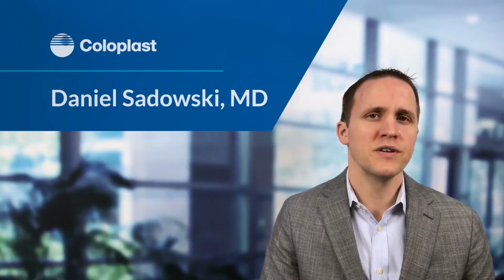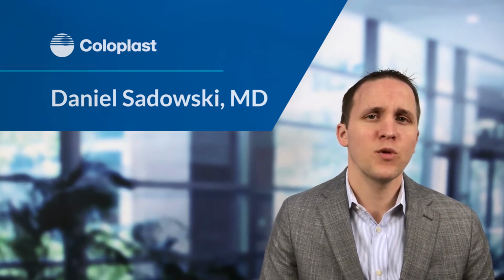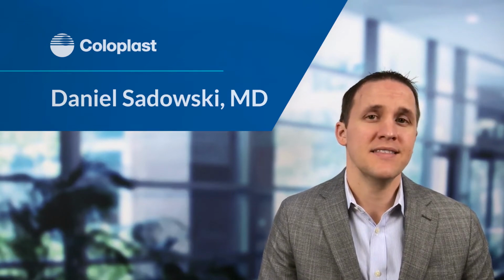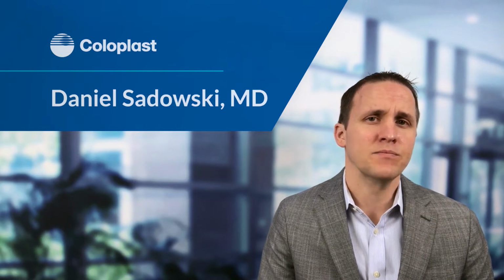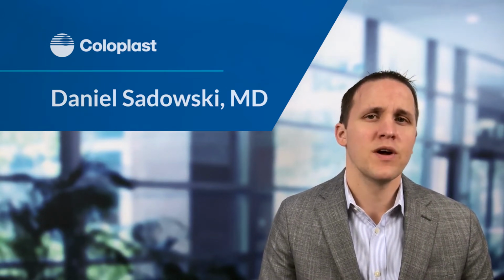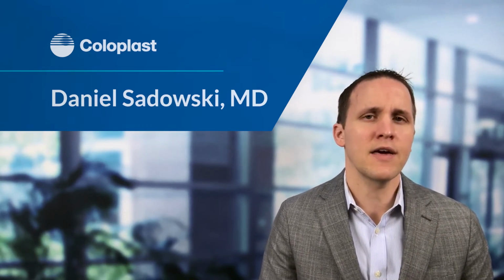During the operation, we use a measuring device to determine the appropriate size of the cylinders that we use for an implant. This is something that we can't modify, we can't change it, so we put in the appropriate size for the patient. We aren't able to put in larger ones with the purpose of gaining length or size.